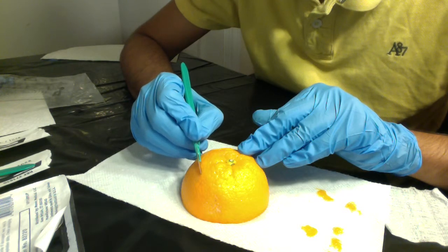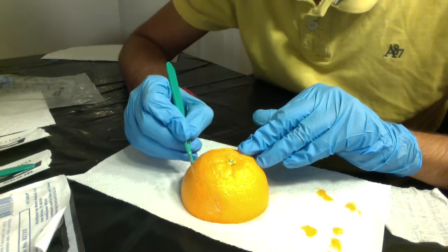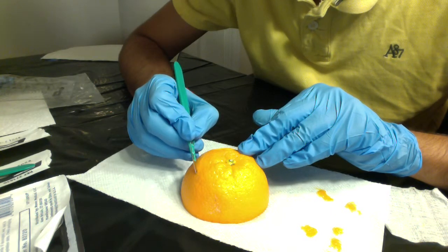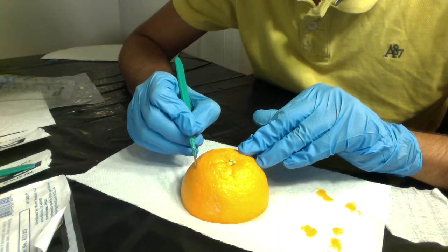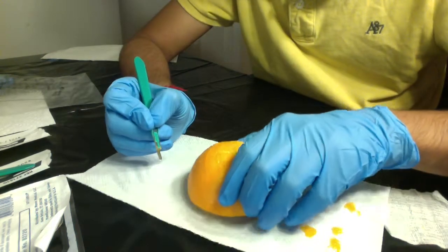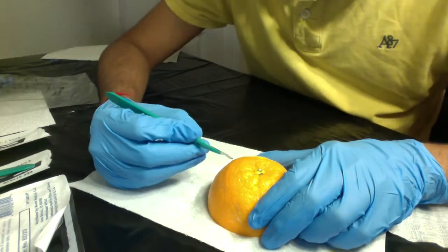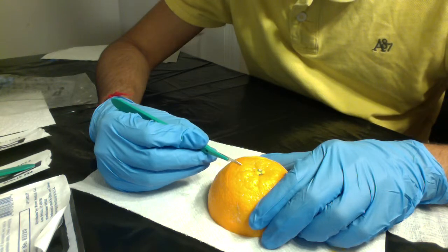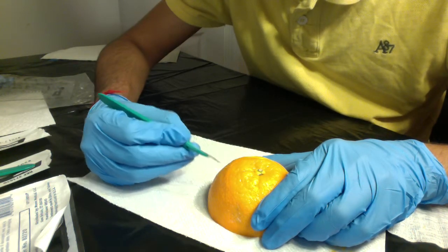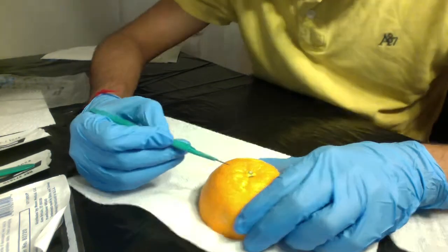I'll be demonstrating how deep I went. This might give you an idea. Using the curved edge of the scalpel, not going to 3. This is 3 horizontally, and the other 3 is going to be vertical. I think I just did a little deeper cut this time.